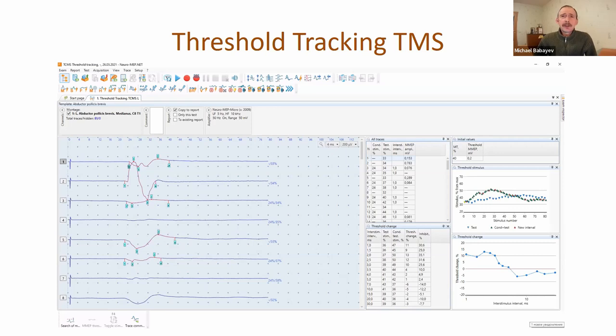In the threshold tracking technique, we use a different approach. In a classical technique, we only change the inter-stimulus interval and use the same stimulus intensity. But in threshold tracking, we not only change the inter-stimulus interval but also change and control stimulus intensity, trying to maintain the same response amplitude. Stimulus intensity has much lower variability - only one to two percent - so it provides very stable data.